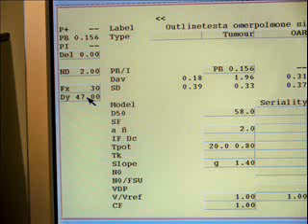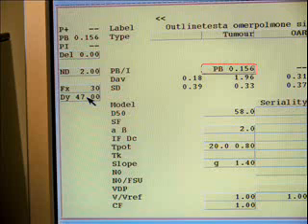The effect of a delayed treatment can be examined. A change in the number of days — with, for example, a week — will automatically be reflected in the TCP value.